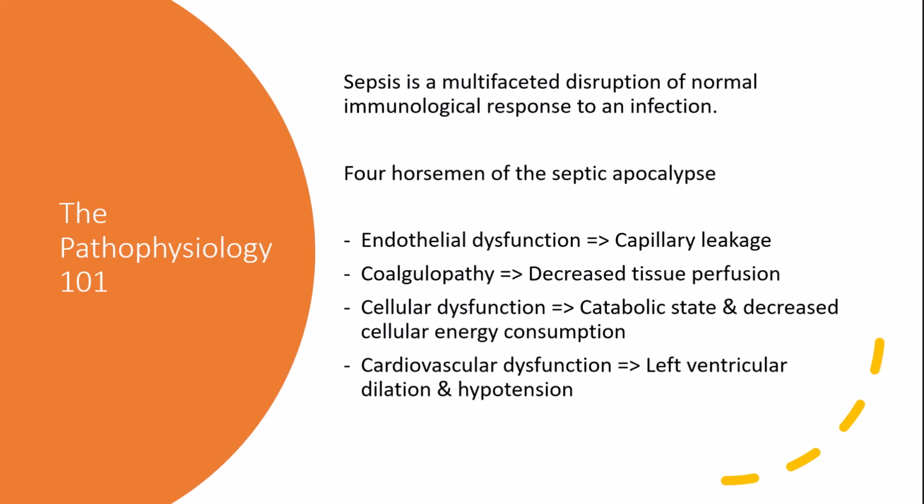And we often in these patients get a state of metabolic acidosis. So the pH of the blood decreases as a result of sepsis. And that's a very important factor to note because we're going to be discussing how end-tidal can help determine whether this patient is potentially in a severe metabolic acidotic state.